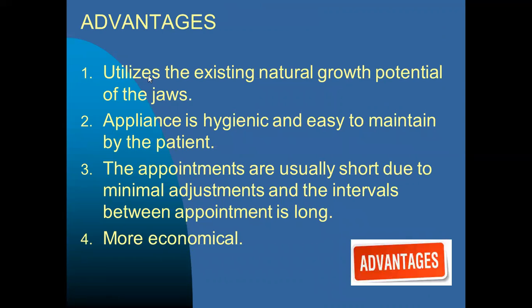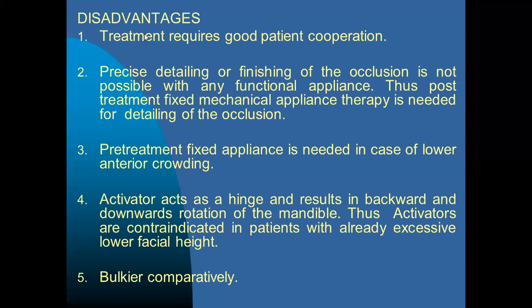The advantages of the Activator include it utilizes the existing natural growth potential of the jaws. The appliance is hygienic and easy to maintain by the patient since it is removable. The appointments are usually short due to minimal adjustments, and the intervals between appointments can be made long, and it is much more economical. The disadvantages of the Activator include the treatment requires good patient cooperation.